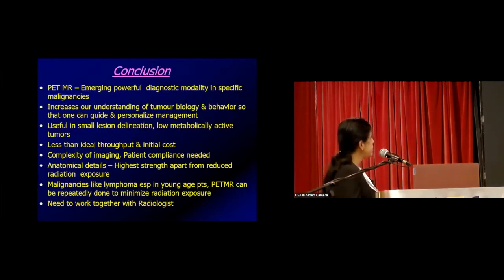So to conclude, PET-MR is a very powerful and emerging diagnostic modality which can be used and should be used only in specific clinical conditions. It increases our understanding of the tumor biology and behavior so that we can guide and personalize management of these patients. It is very useful in the delineation of small tumors, especially low metabolically active tumors. It provides more accurate anatomical details.